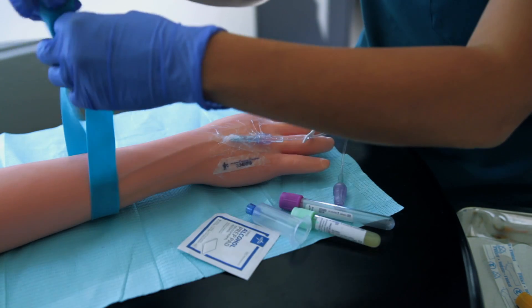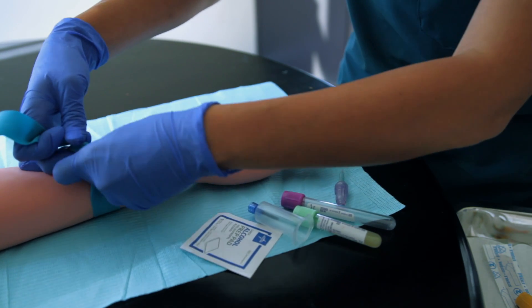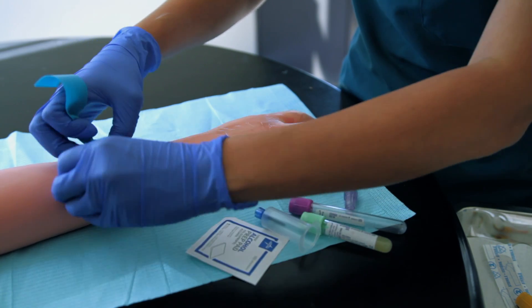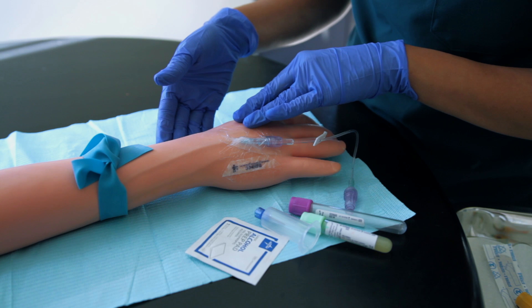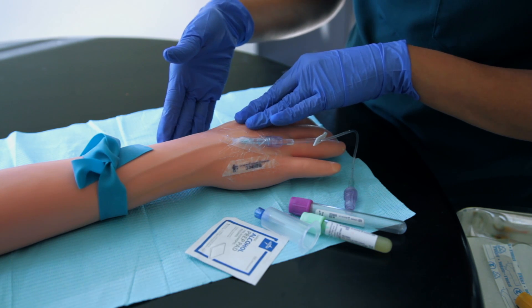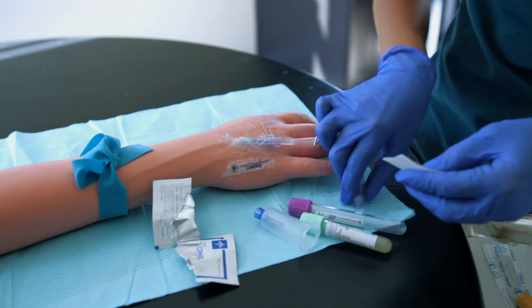Once you've done all that, you're going to apply the tourniquet. The goal is to produce venous congestion. You don't want it too tight to where it's obstructing the radial artery and impairing circulation. You want to be able to palpate the radial artery, as I can.